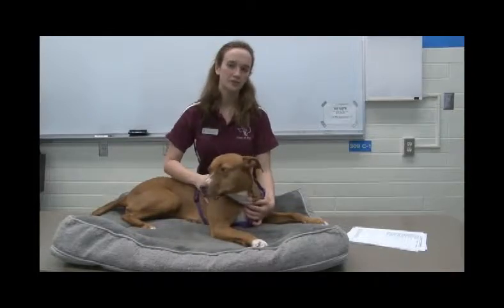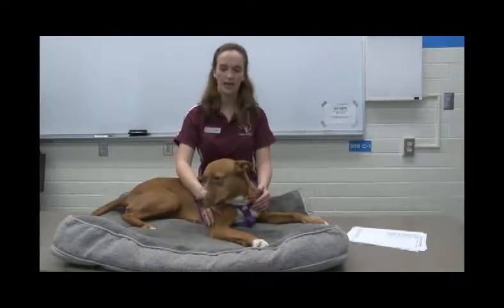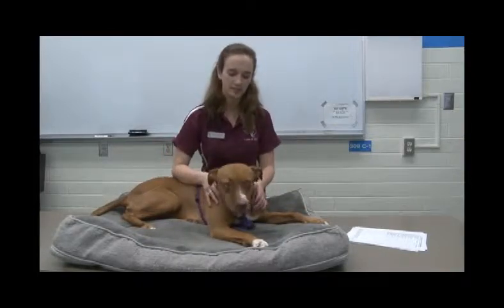I'm now going to show you how to find the cephalic vein on a dog or a cat. This is Kelty, she'll be helping me.